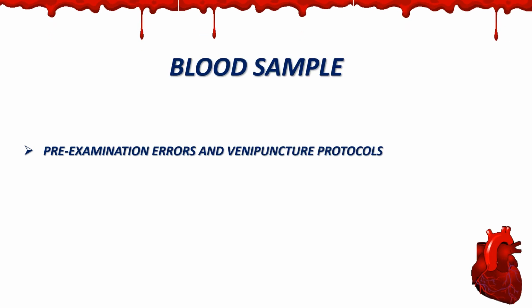All right. So let's start talking about blood samples. When you go to a lab, or a medical office, or a hospital and they take your blood, if the person taking your blood does not follow protocols and guidelines, between 60 to 93% of errors will happen to your blood test result.